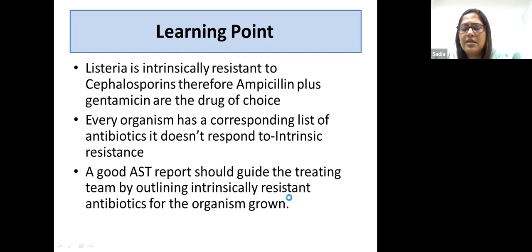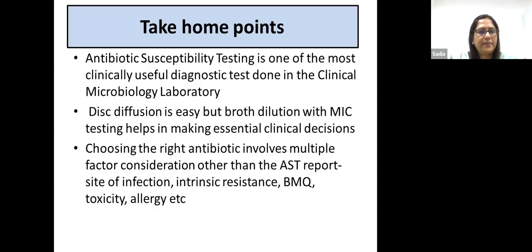Azithromycin is intrinsically resistant in E. coli. You don't need to remember all this, but your AST report should be giving you, or it is advisable that AST reports tell you, that this group of bugs is intrinsically resistant to this particular antibiotic. Right.